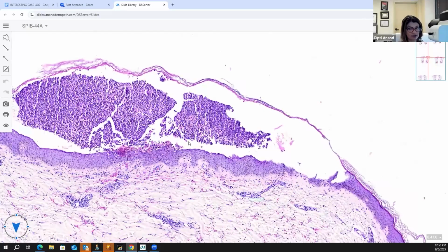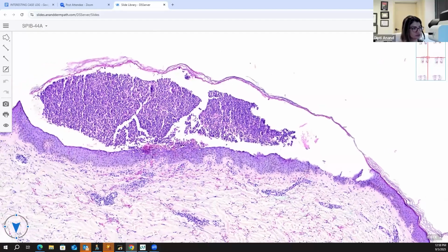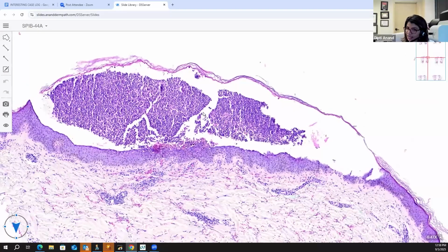Okay, you are correct. This is from a patient with bullous impetigo, but this is how I want you to think about that slide. Does everybody get that? Is everybody good with that? If they sent you this and they gave you a patient picture which looks classic for psoriasis, it would be pustular psoriasis. If you have those honey crusts, it would be bullous impetigo. All good with this?